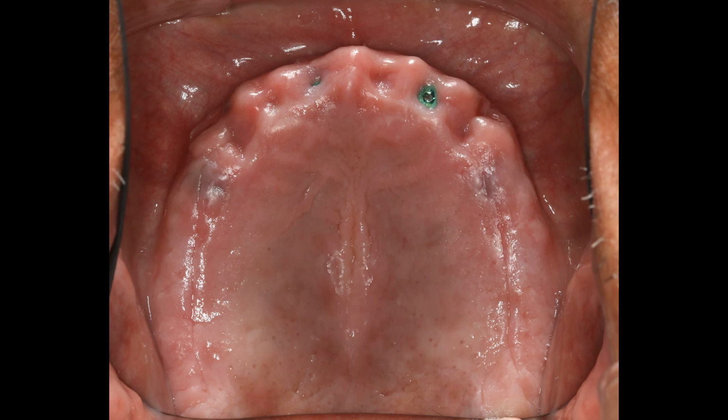Same day, the mirror view of the upper arch. And again, I'd just like to point out these papilla that have been maintained are crucially important in getting the right contours for the future prosthesis. And you hear me talk about not removing bone, especially in the upper arch. Unlike the all-on-4 technique, we do not remove bone in the upper arch. If you remove bone in the upper arch, you will never maintain any of this gingival architecture, and your contours will never be like natural teeth.